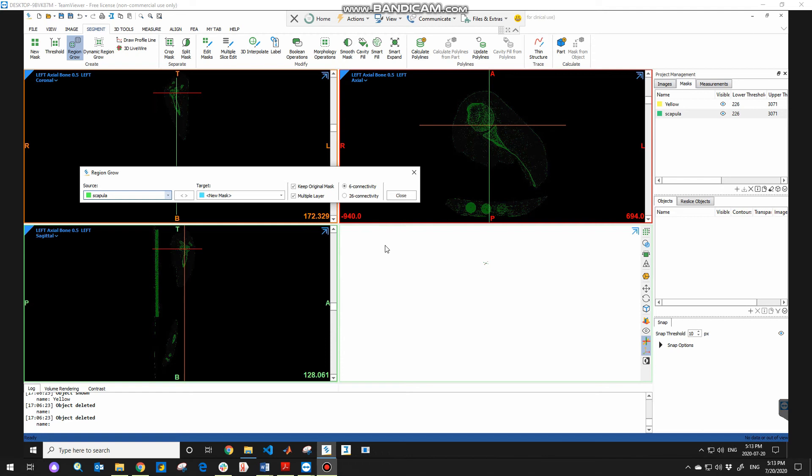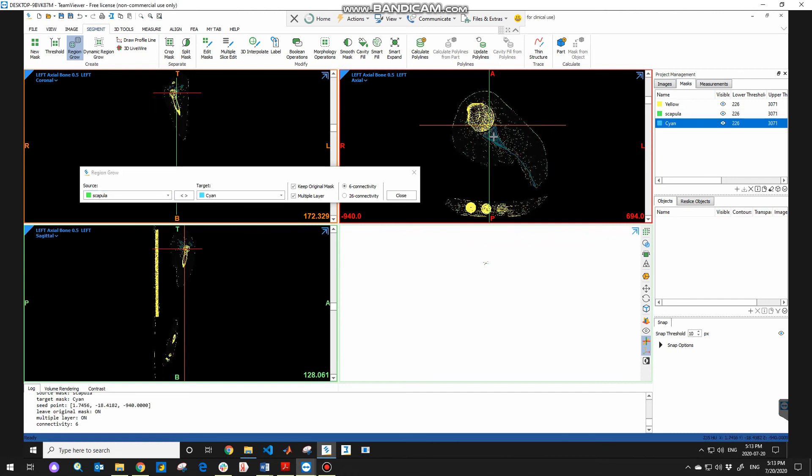Afterwards, you need to hover your circle over one of the anatomical planes and choose your desired bone, which in my case is the scapula to be segmented. So I'll choose this one, this is the scapula. And as you can see, the scapula is separated from the other bones in blue color.